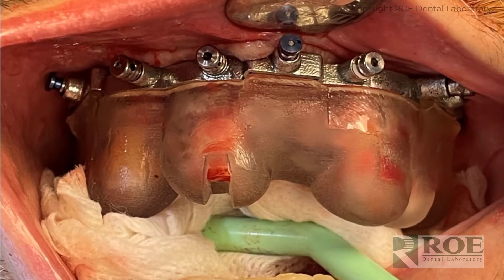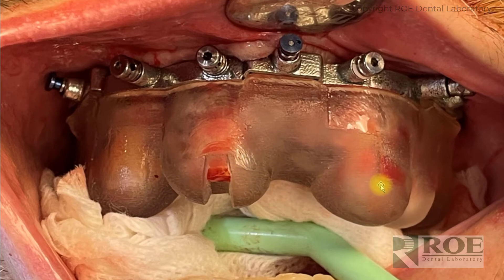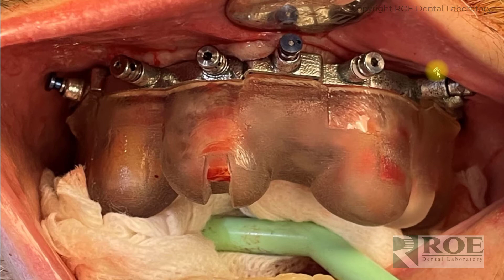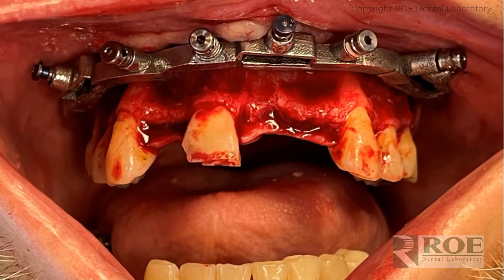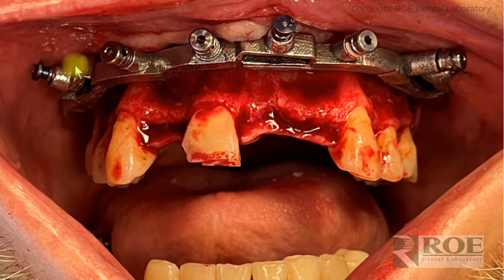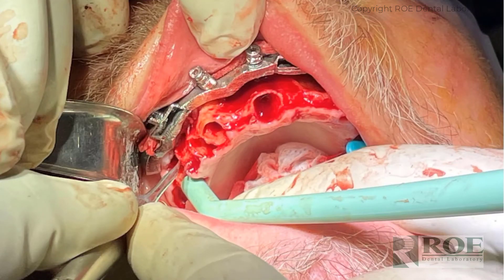After laying the flap, the pin guide goes in with the fixation base together and is held firmly against the teeth. An assistant can hold this while the doctor drills, but it must not move during the pinning process. The pins have to be in the right place because the fixation base must be in the perfect position — the subsequent guides stacked on top will be in a different position if it's off. Hold it firm, make sure there is no tissue in the way. Sometimes a little more flapping is needed after the fixation base is in, especially on the lingual if bone reduction is required there.